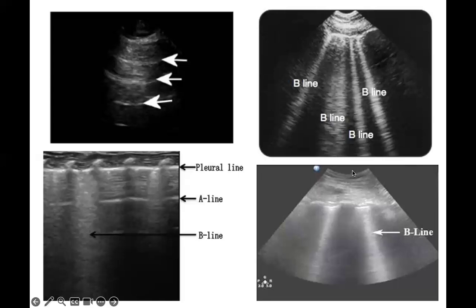Versus here, this is the abdominal probe. So it's a bigger footprint, goes over multiple rib spaces, rib shadow, rib shadow, rib shadow. Here's your visceral and parietal pleura, and you can see that there's a huge B line. It's a bunch of B lines shoved together to look as one bright line, but this would certainly be considered more than 3 B lines, and this is a B profile. But I don't think you can count them as much. And so if you were doing them over time, I find the top probe to be easier to see how the patient's improving, hopefully.